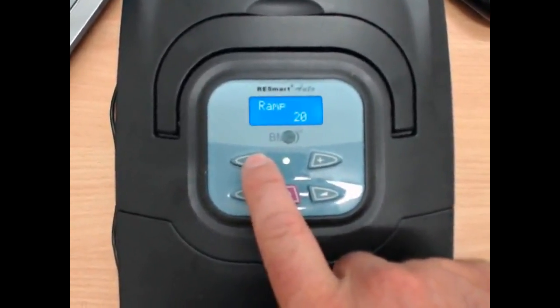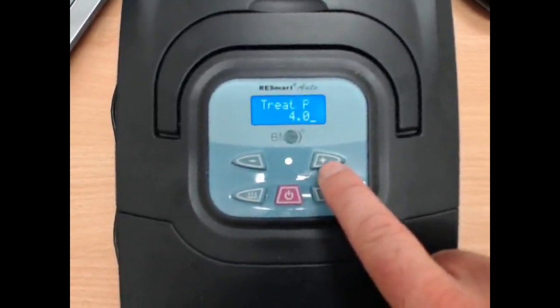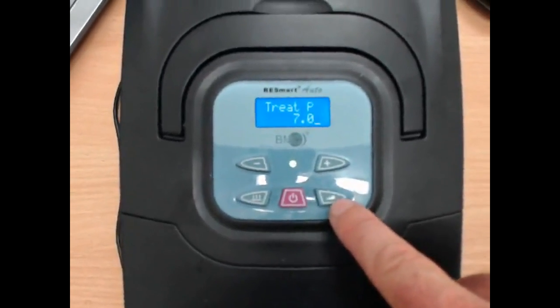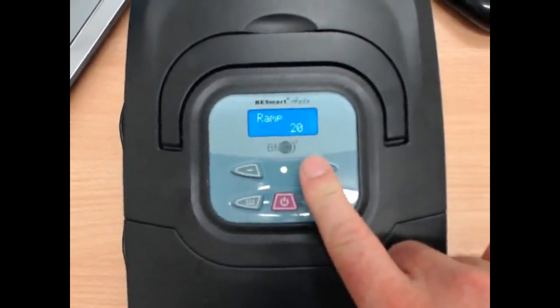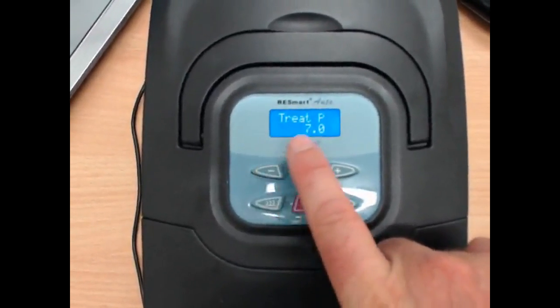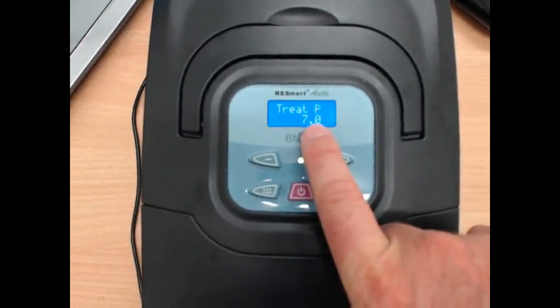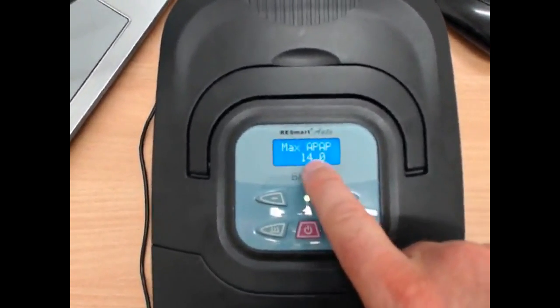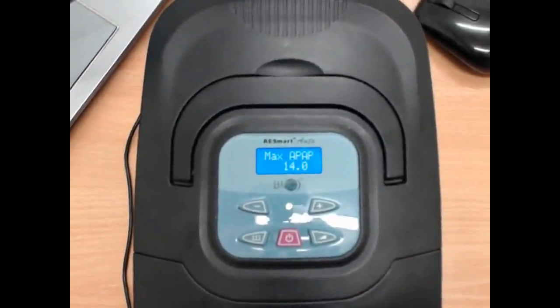So, let's just go back. We've got the ramp at the moment of 20 minutes. We've got a treatment P of 4. So I'm just going to change this so we get a little bit of an understanding of what's going on. I'm going to change this to 7. Alright, so that's at 7 now. So the way I've got this set up at the moment, the machine is going to go from an initial pressure of 4 up to a treatment pressure of 7. Once it goes to 7, it's going to then automatically titrate between 7 and the max pressure, so between 7 and 14. So it's a little bit confusing, but that's basically how you set it.